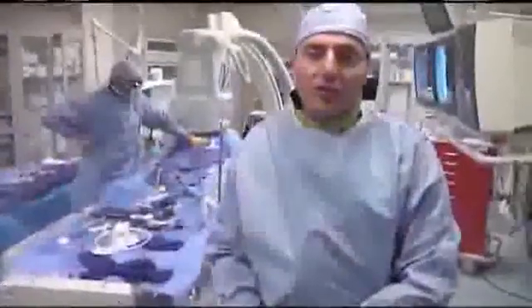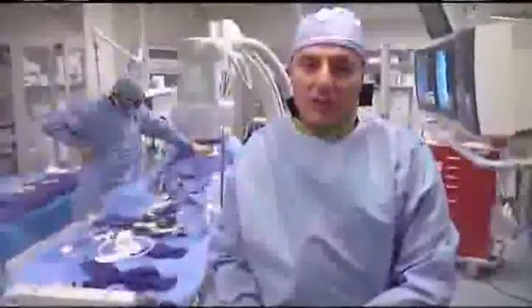In conclusion, the procedure was done through a 6 French sheath, which is about half the size of a dime. This concludes our case of a complex iliac total occlusion.